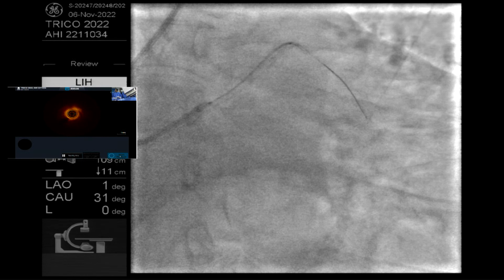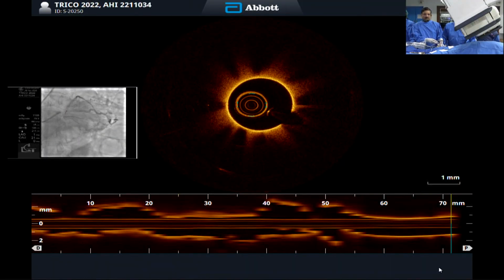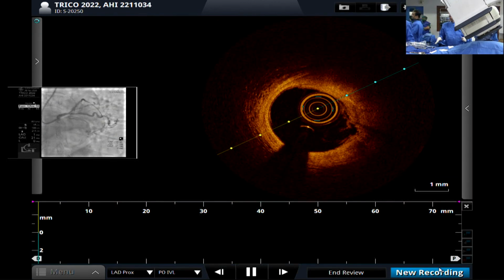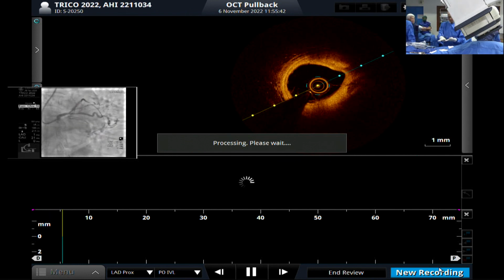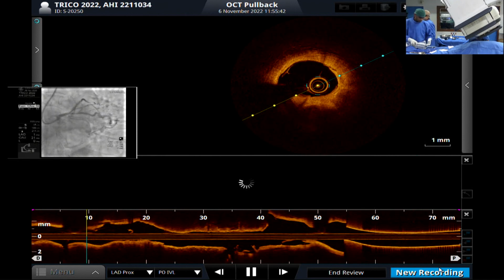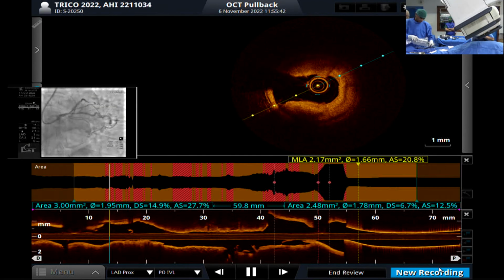Go, inject. I give you calcium, always a delayed injection; regular, and a long lesion, a very quick injection. This is the strategy we have. Yes, it's a nice study. Now, Professor Akasaka in action, he will discuss.